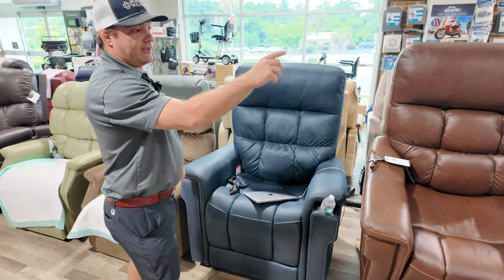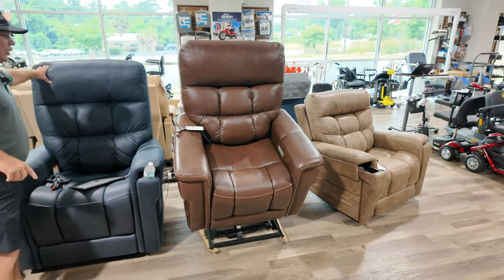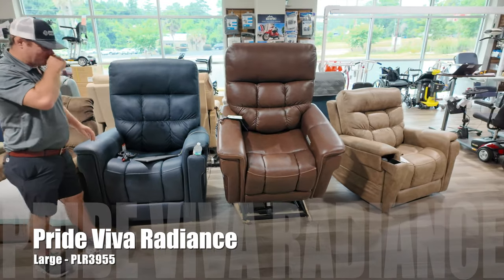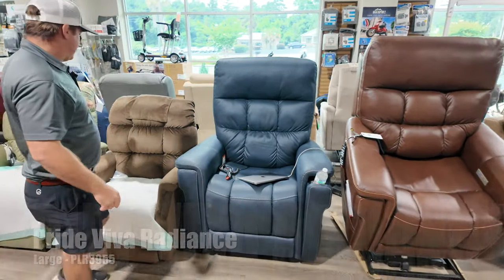It comes in three sizes. That chair I pointed out earlier comes in four sizes. This is the tall version of that chair down there. They also have a small and medium.